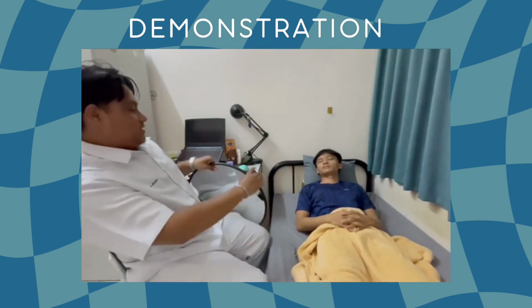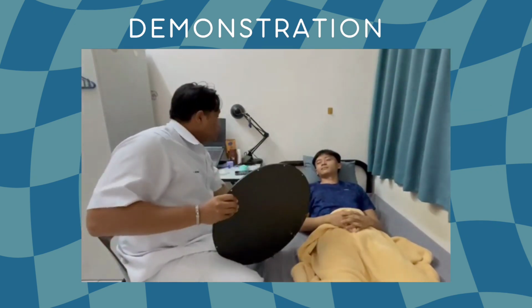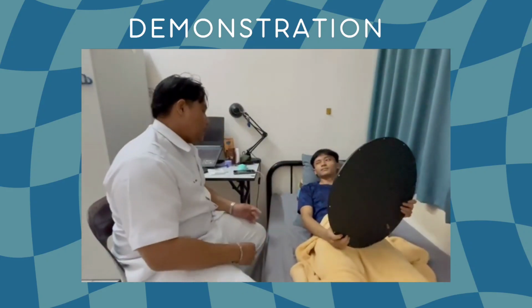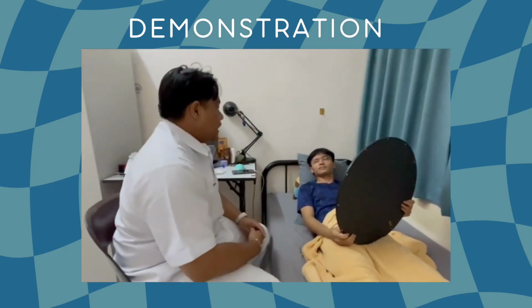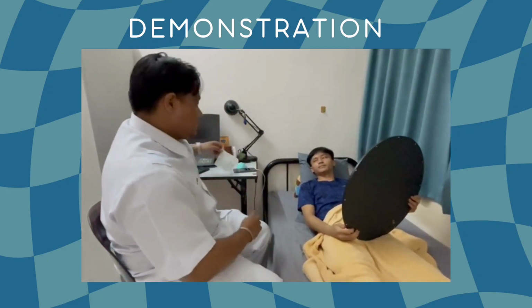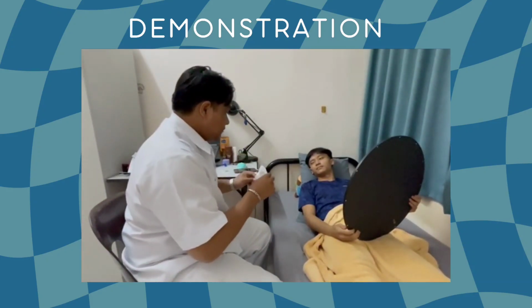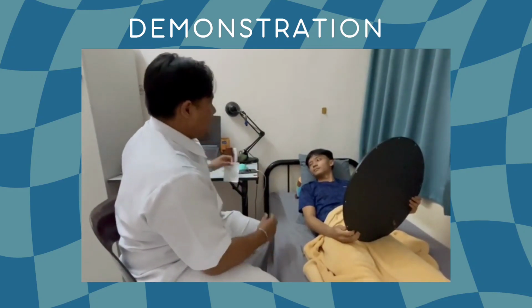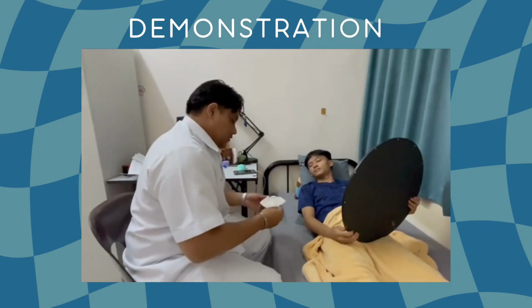Right. So Mr. Jeremy, I got a mirror for you. I'll place it in front of you so that when I demonstrate, you'll see how I will do it and how I apply the eye shield for you. Right. So this is an eye shield and this is my micropore. So how to apply an eye shield? First we need to open it.